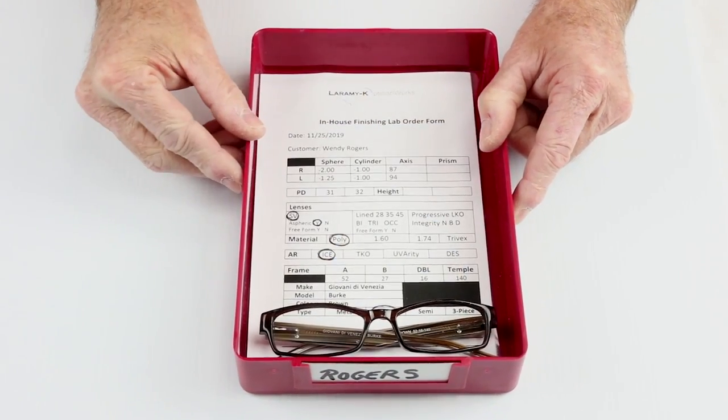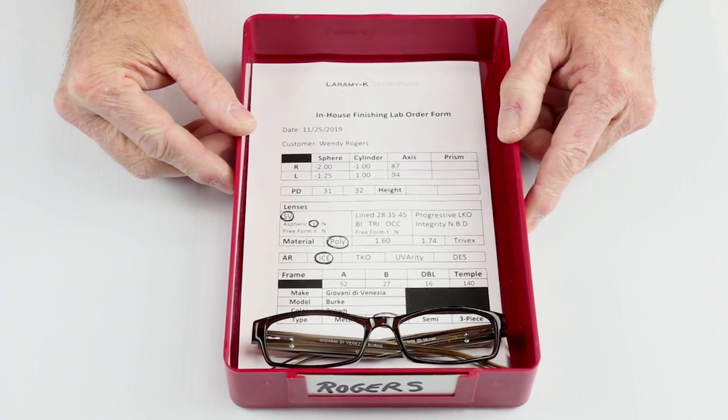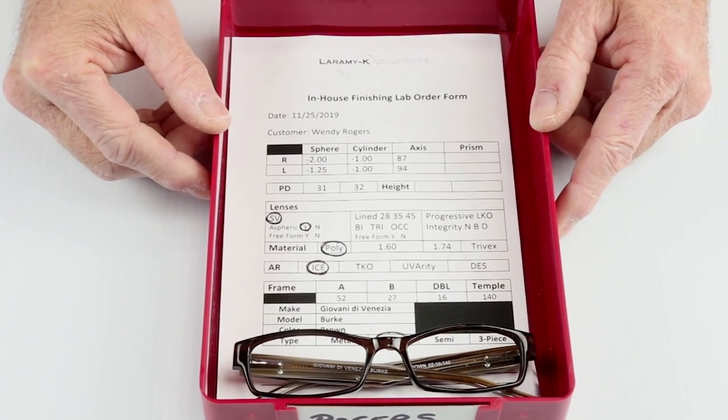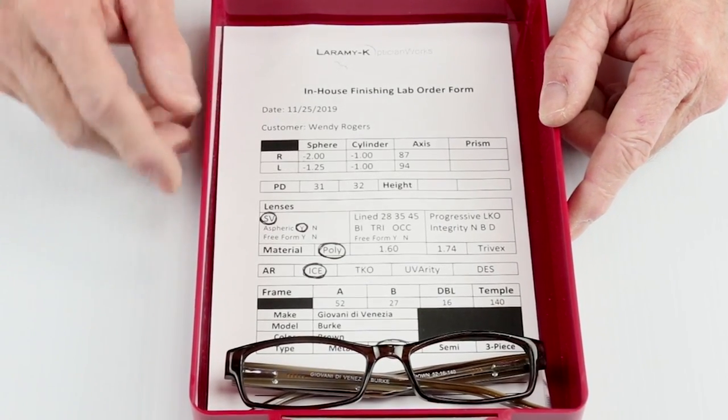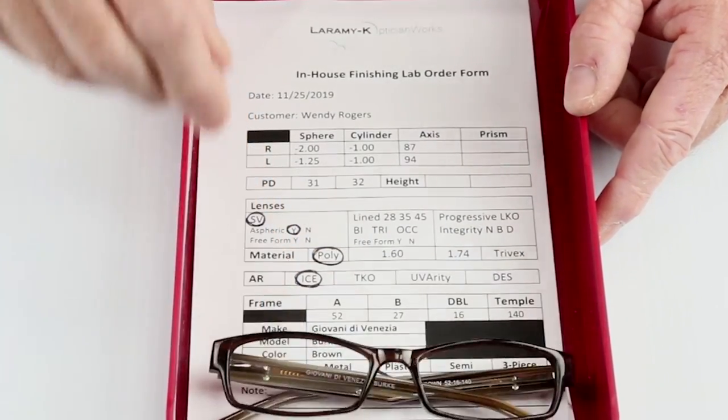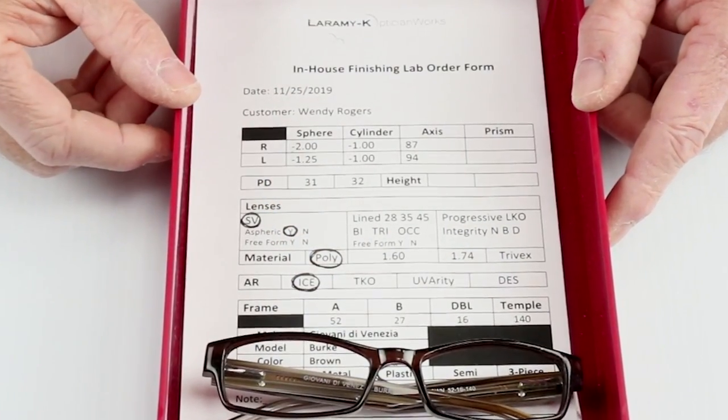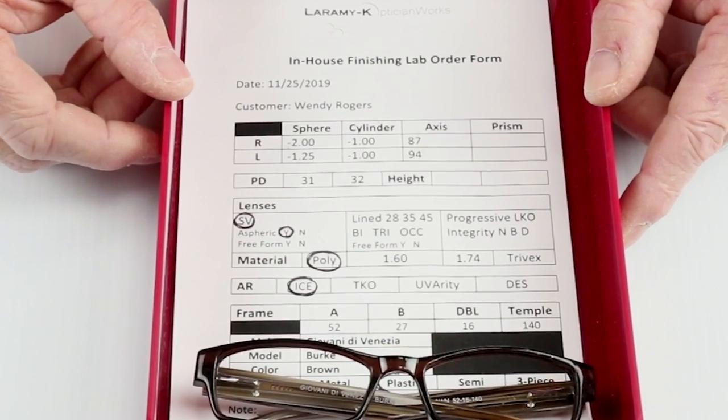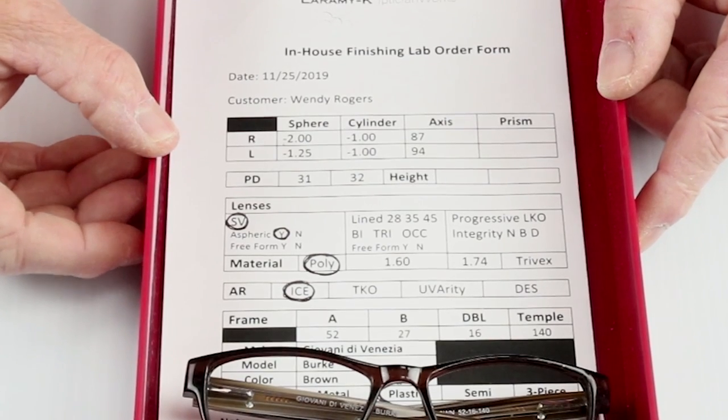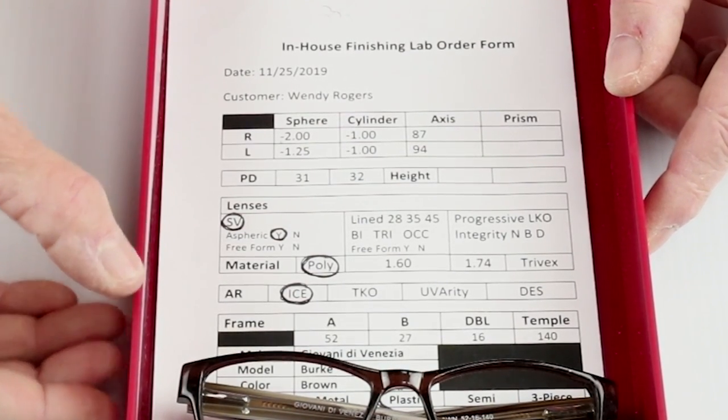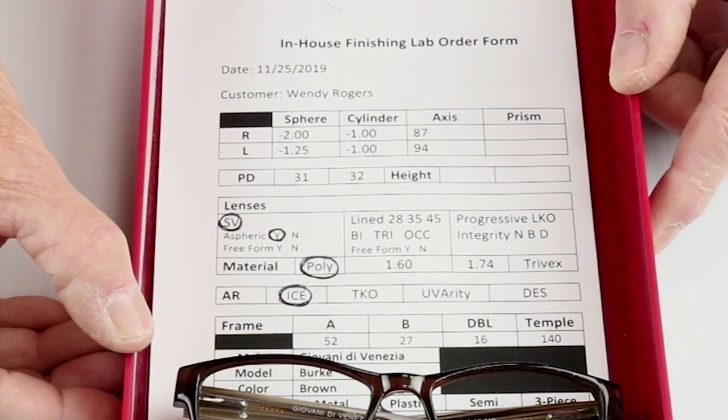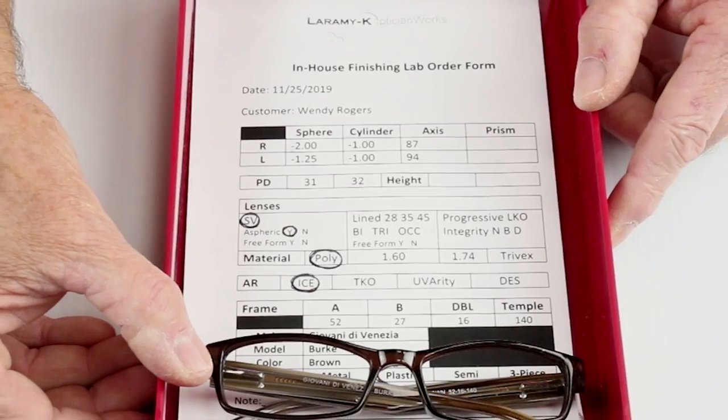This is a very typical order for a basic single vision job that you would run in a matter of a couple of minutes for a patient that might be waiting for their glasses. It's going to have a job order form which the optician just filled out, the frame that the patient chose, and the lab order form is going to give you all the information that you need in order to run the job. Most important: prescription, patient PD, the lens type, the material, any non-glare or AR coatings, and all of your frame information to make sure you got the right frame in the right tray.